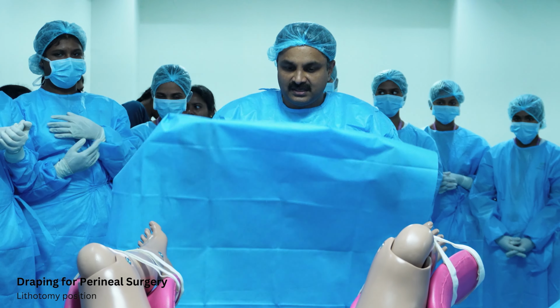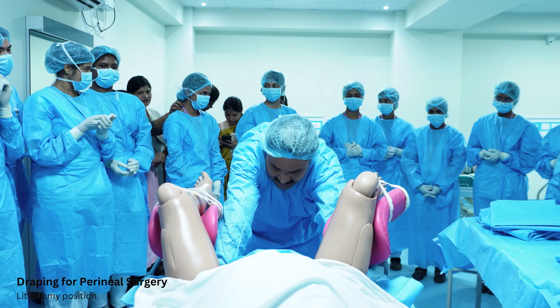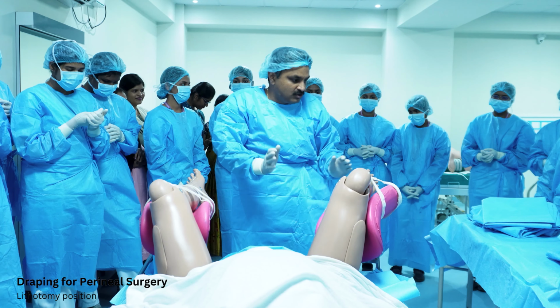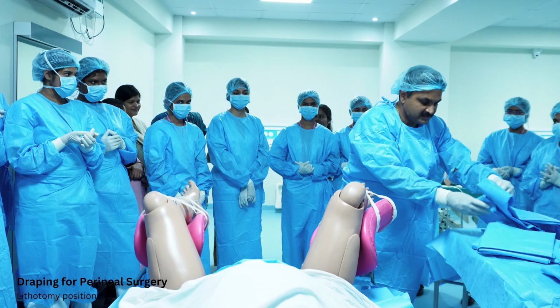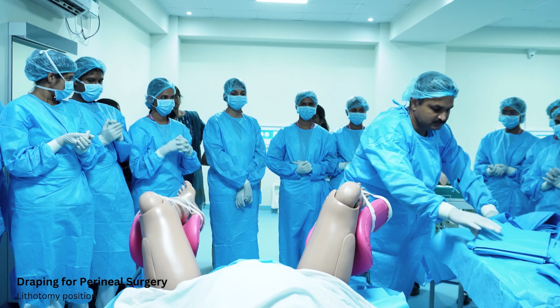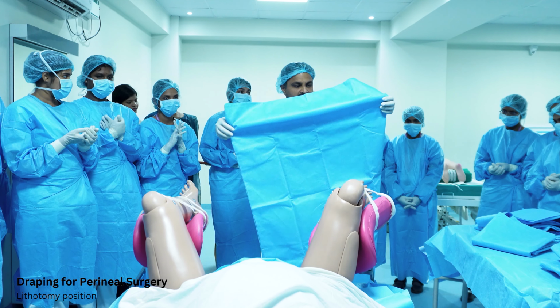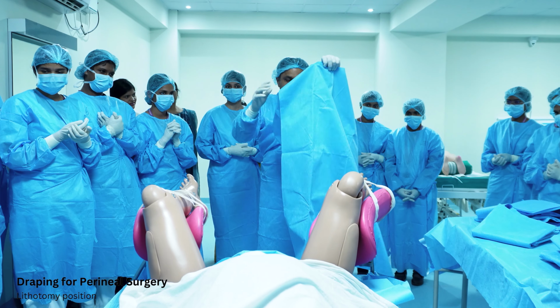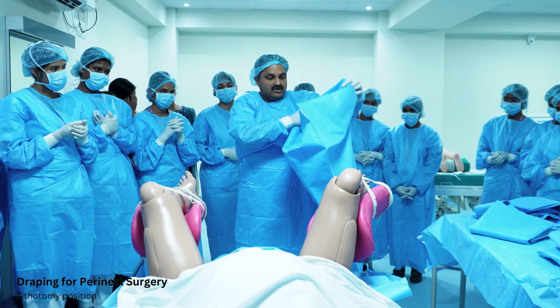So, we are going to start, and first I am going to place a bottom drape just to have an initial sterile field, and I am ensuring that my hands are not touching anywhere. And now what I will do is the leggings. I got two leggings, so I am going to cover each leg. I got the opening here, and usually there will be a slit, so that slit has to go downward.